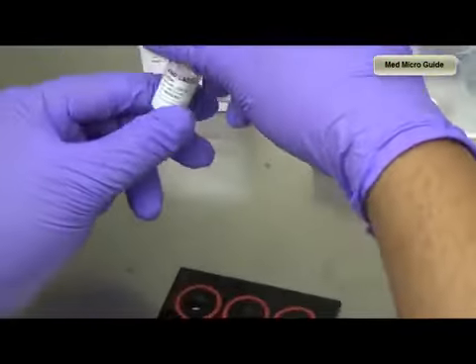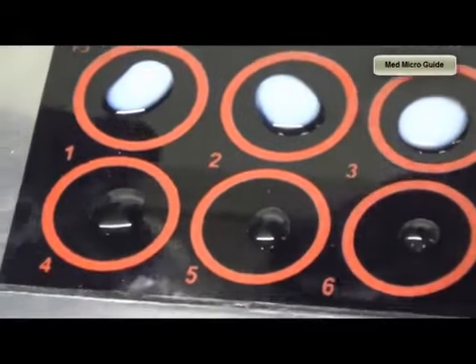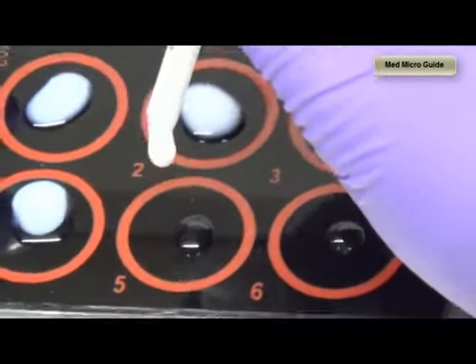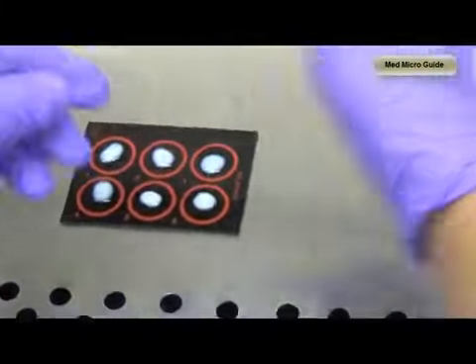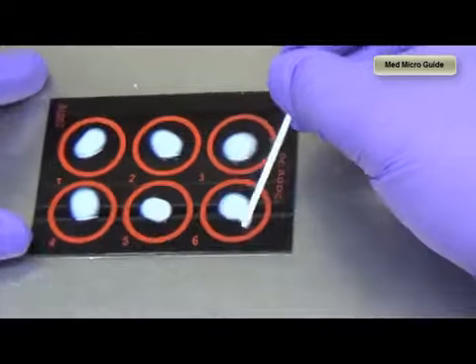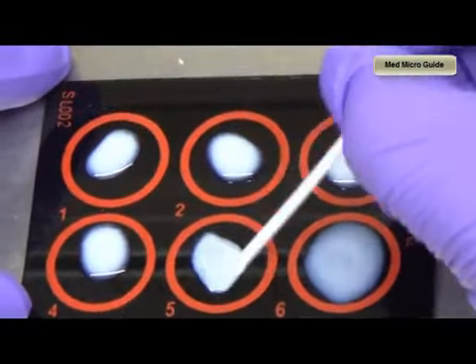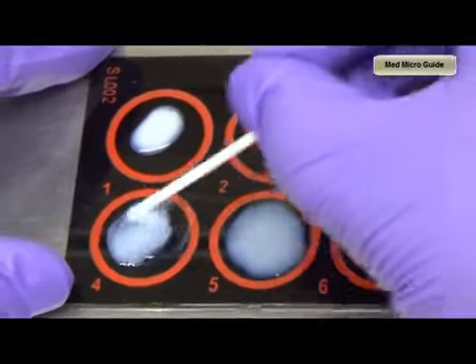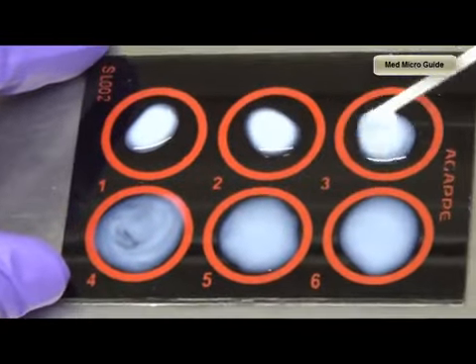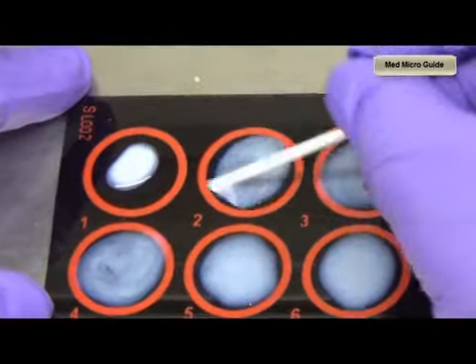After the dilution, we will add the ASO latex reagent, 1 drop to each of the serum dilutions. Once the ASO reagent is added to the diluted serum, we will mix the reagent and serum using an applicator stick. The serum has to be mixed from the highest dilution. That is, we start from 1 in 64, then continue with 1 in 32, 1 in 16, 1 in 8, 1 in 4 and 1 in 2.